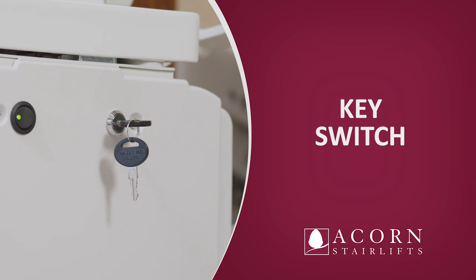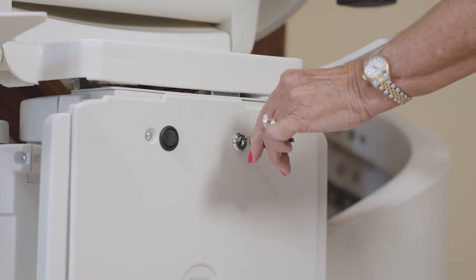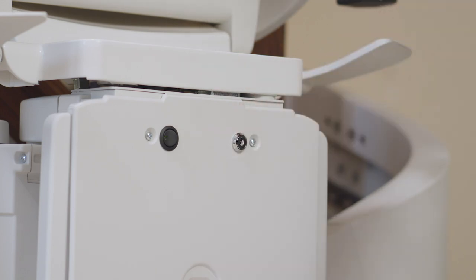Key switch. You will find the key switch on the front carriage cover. For the unit to operate, the key must be inserted and turned to the right or clockwise position. When the key is turned to the left or withdrawn, the stairlift will not run. The key can be removed to prevent any unauthorized use of the stairlift. This will not affect the charging of the batteries.